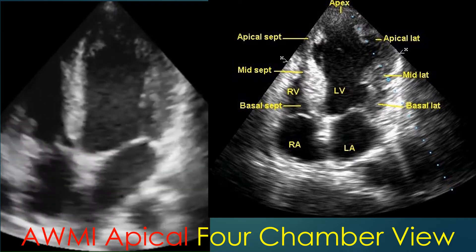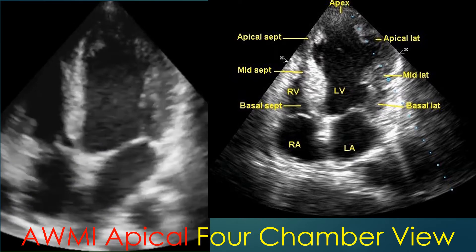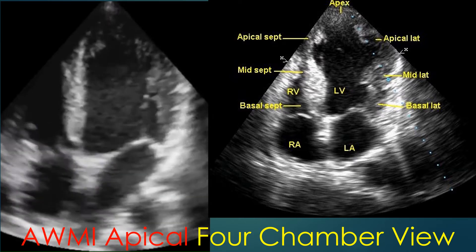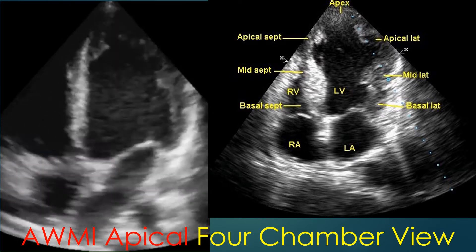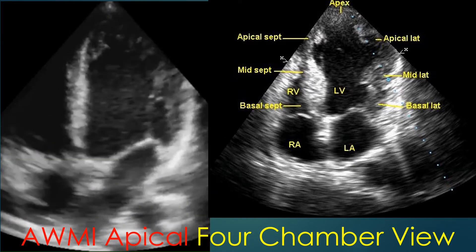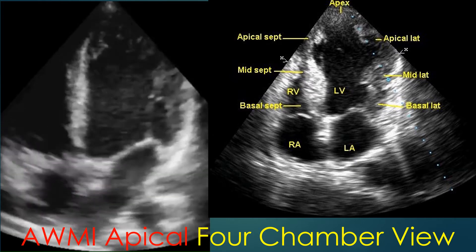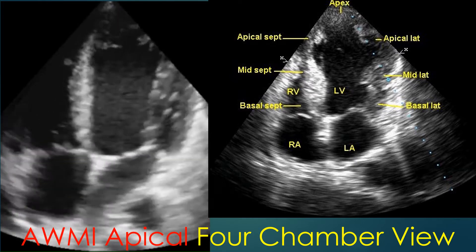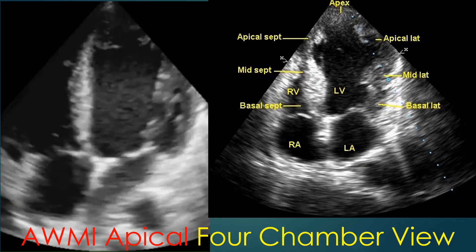Apical four-chamber view showing hypokinesia of mid-septal, apical septal, apical, and apical lateral segments. Other segments in this view are basal septal, mid-lateral, and basal lateral. Mitral and tricuspid valves are seen well. Chordae tendineae and papillary muscles are also seen.